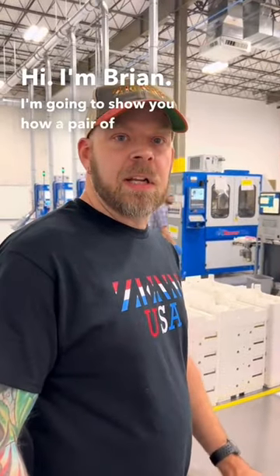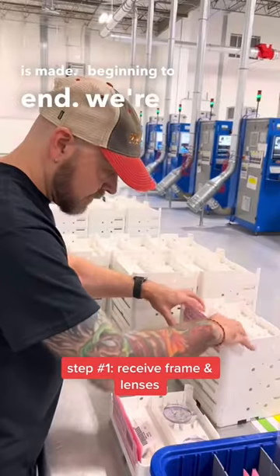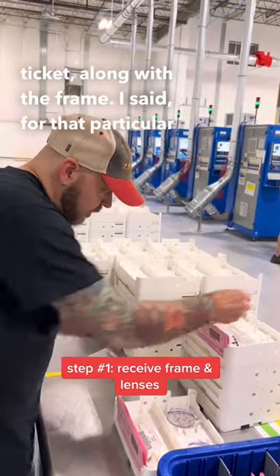Hi, I'm Brian. I'm going to show you how a pair of Zinnies is made, beginning to end. We're replacing the work ticket along with the frame for that particular job.